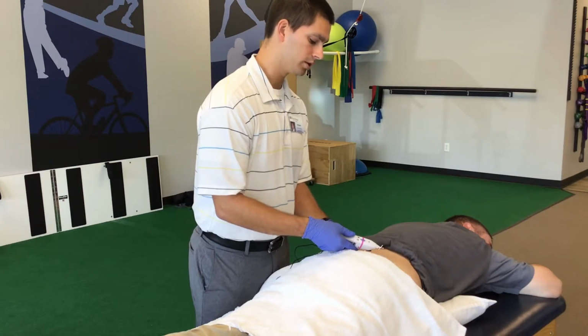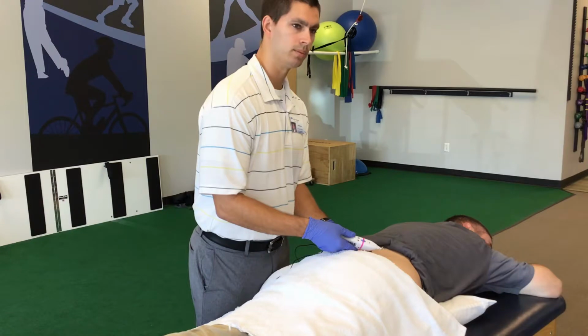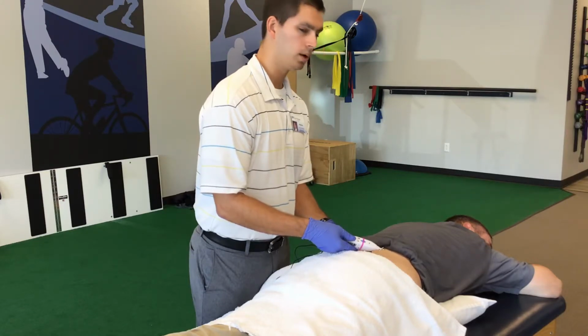But I just give Josh the cue. Josh, I want you to go ahead and let me know when you first start to feel anything. And so we're just turning this pointer up here to the point where Josh feels something. So he's feeling it there. Now I would cue him, hey, I want it to be a comfortable sensation, just like a little bit of a rhythmic contraction. Back off just a little bit. A little too much. There you go. There we go. So then we hold this here for about 30 to 45 seconds.